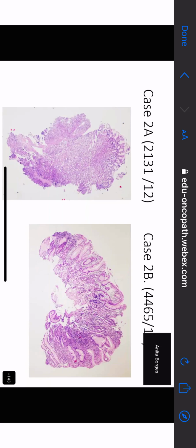All right. Anything else you see over here, Shweta, on the left-hand side? The glands, ma'am. Is there anything wrong with the gastric mucosa and the glands? Is there any normal tissue seen?